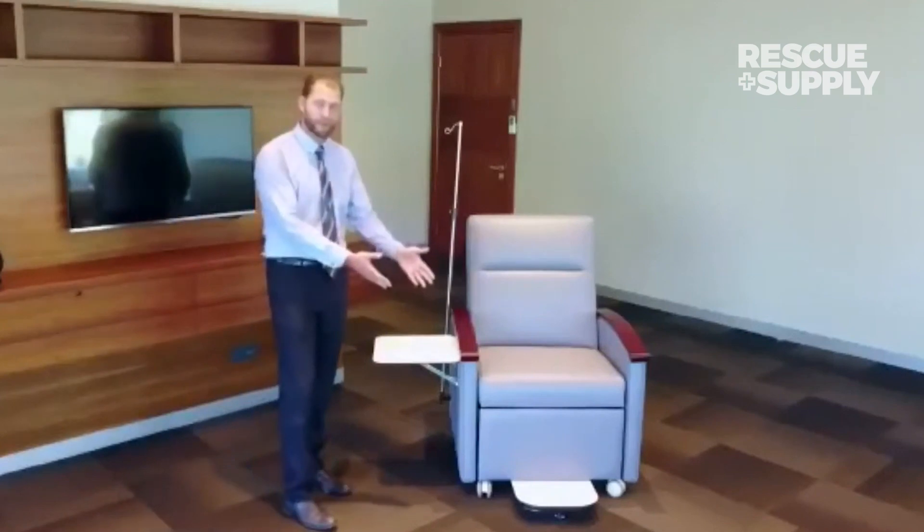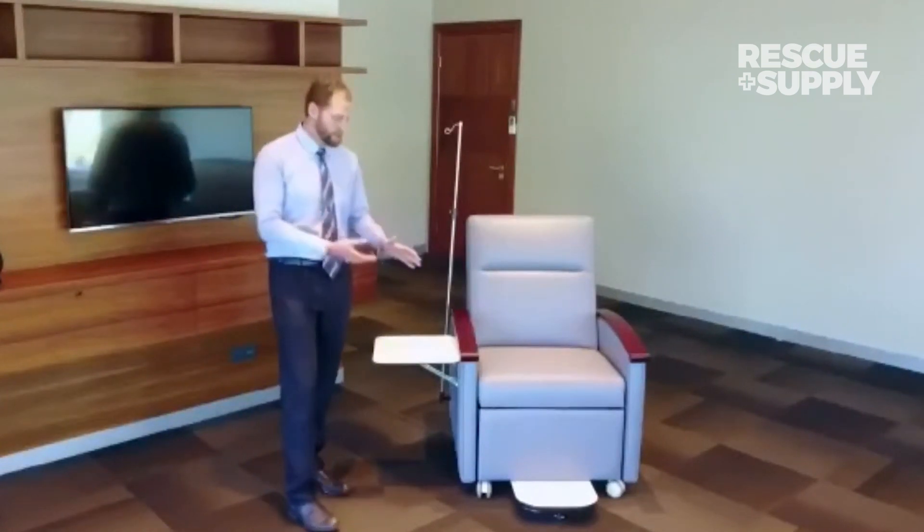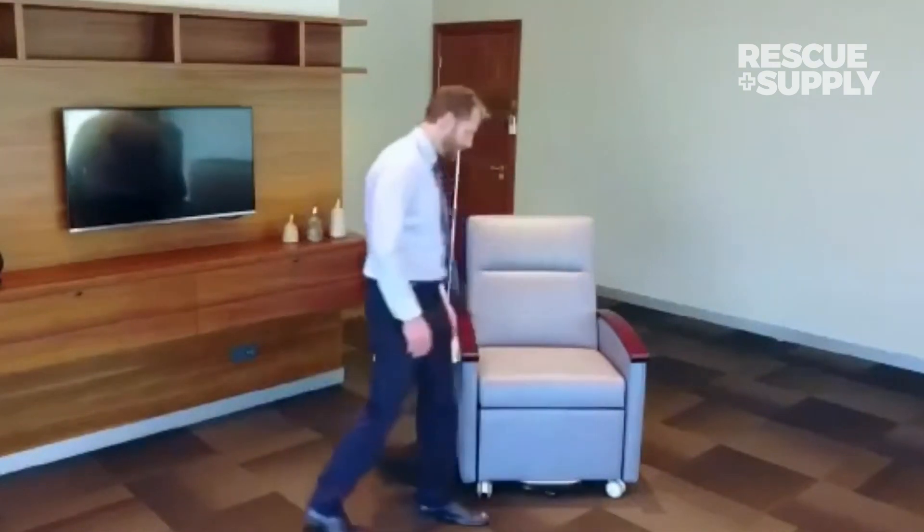Of course the obvious ones — the footrest. It does have a caster underneath, so in transport position please pull that out for transport. You can push it in with your foot.